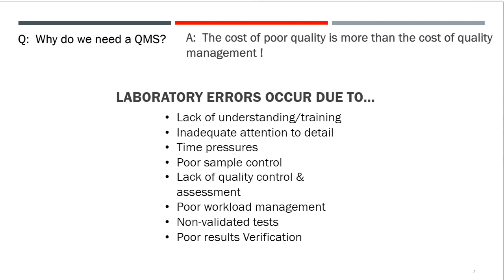Which also raises a question we should probably address. How do we define quality? What is quality for our purposes here today? Let's use the definition that says quality is providing the right result at the right time for the right sample from the right patient. And that's the definition we're going to work with.